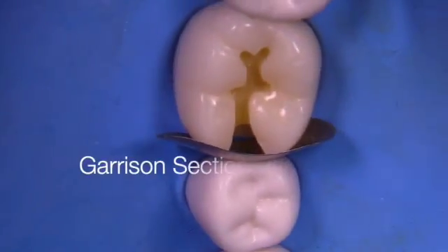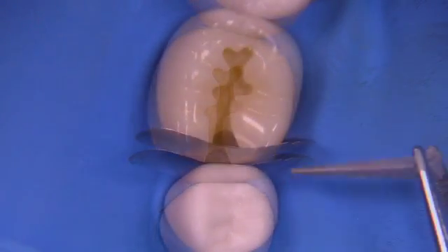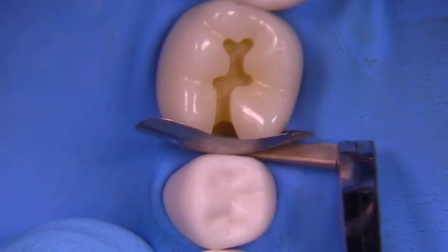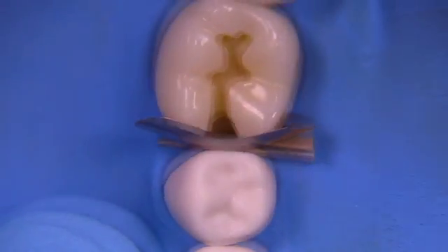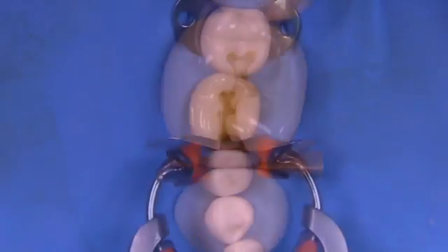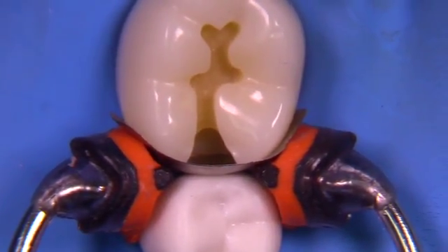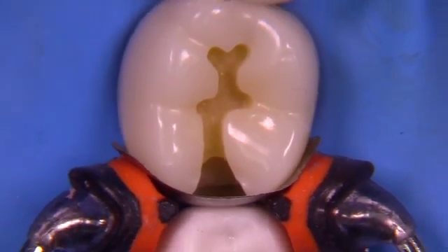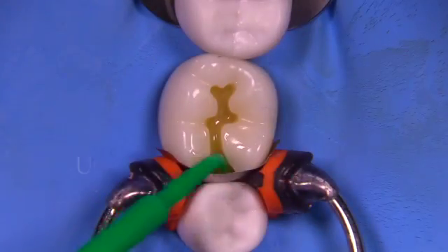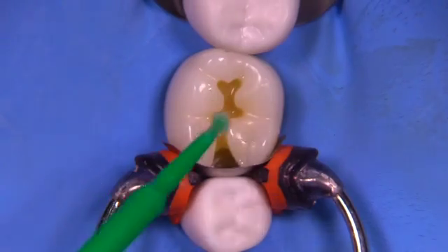Let's go ahead and start with a Garrison matrix. This is a sectional matrix that fits really easily between the teeth, but you're not going to get a closure at the gingival unless you use a wedge. I'm using a wooden wedge here — you can certainly use the wedges that come with this system, but I've just gotten used to using a wooden wedge. We're going to use a Garrison G-ring to create separation. The wedge is going to be sealing the gingival, the band is going to be creating the contours, and the Garrison ring is going to create the separation.